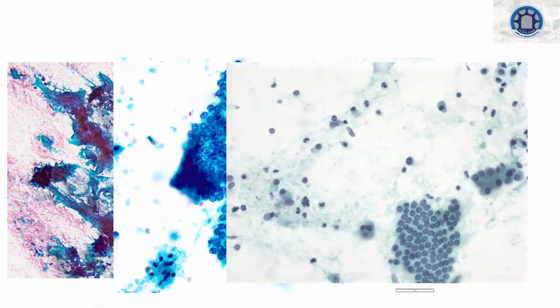Middle-aged male with history of alcohol abuse. You're seeing slightly reactive ductal epithelium. Acini, but not many, atrophic, background showing inflammatory cells. What is the diagnosis? Fast, please, if you want me to finish this fast. No answer? No answer in the chat box. So residents are not aware of the clinical history too. I had high hopes for Calicut residents.